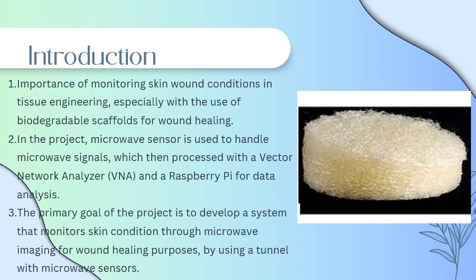So the primary goal of the project is to develop a system that can monitor the skin condition through microwave imaging for wound healing purposes by using a tunnel with a microwave sensor.